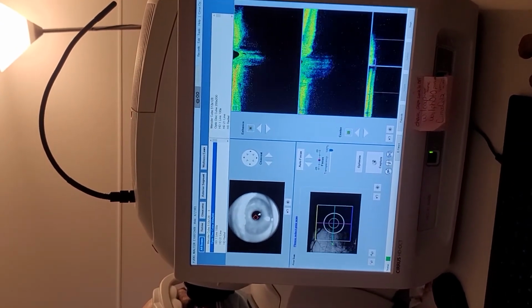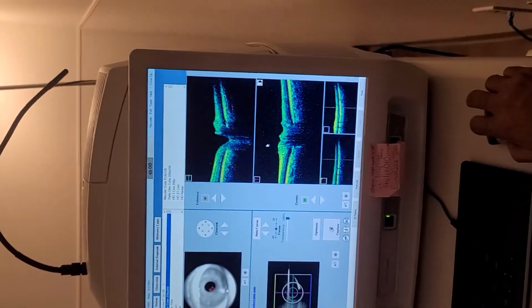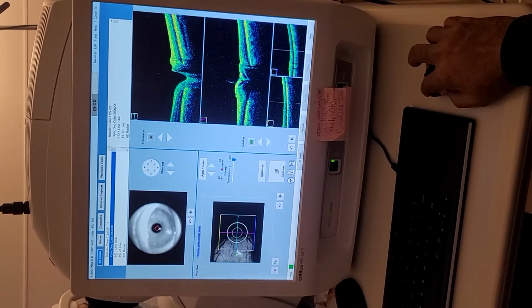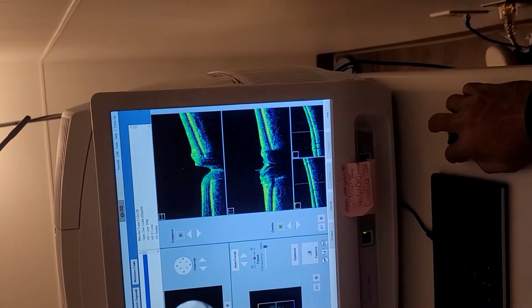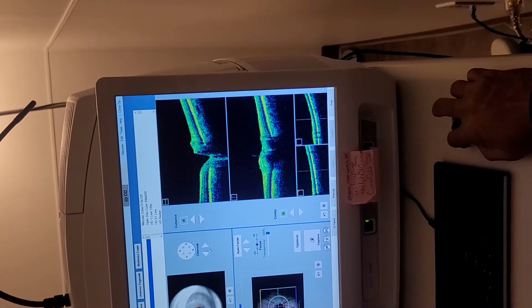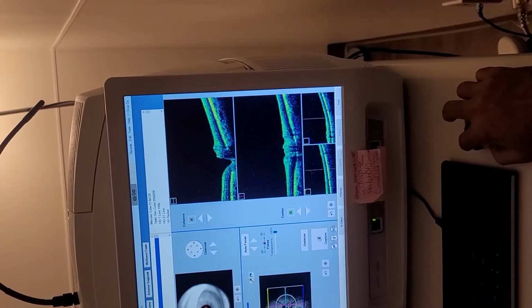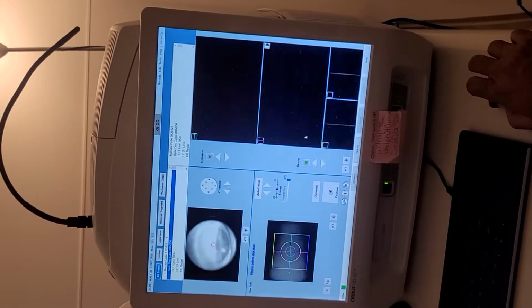Compare. So now you want to bring this down, so use your wheel to bring it down in the center. And you want to kind of bring that target to the center of his pupil. It's very difficult to bring it in okay, as long as you can get it over there. Difficult. That's why, okay, so your mouse, and this is good. So right here you have his optic nerve, but you need this more in the center. I would optimize him.